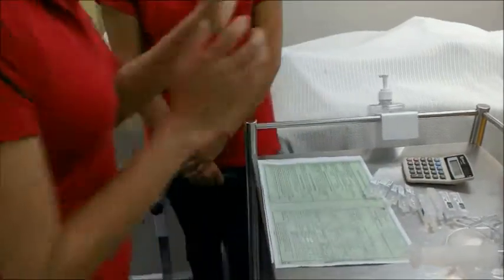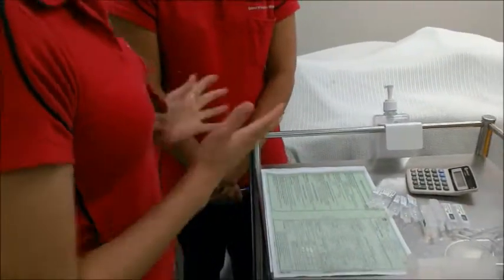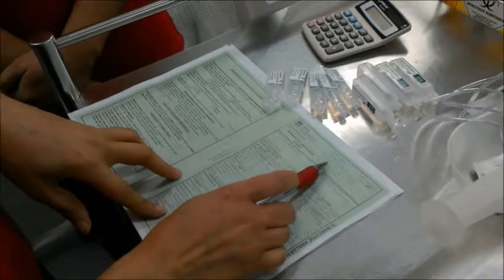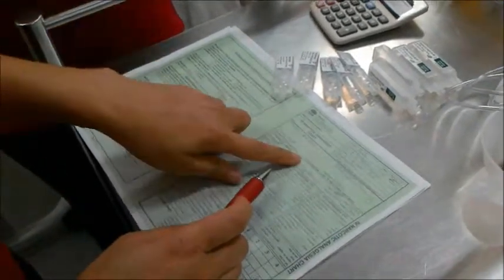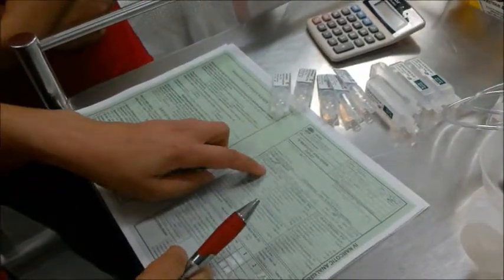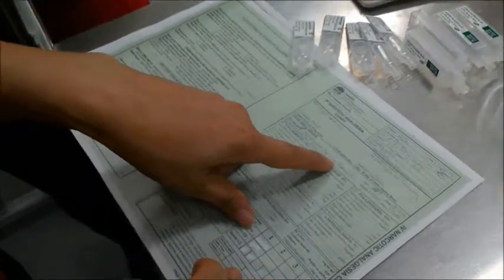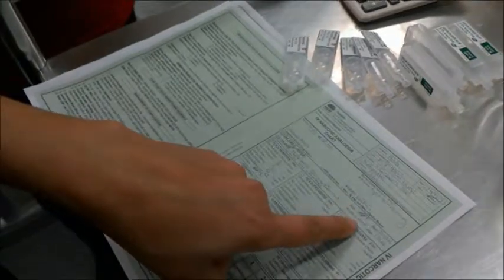Okay, before I go to my patient, I want to do my third drug check since I have primed my line. So would you be my second RN to check these drugs with me? Okay, my patient name is Adib Mariam. Her date of birth is 7th of 1st, 1969. She is under Dr. Hunt. She has a history of post-fracture ribs and she doesn't have any allergies. Today she has been prescribed morphine for pain relief, 50 mg in 50 ml. It's been signed and dated by the doctors.